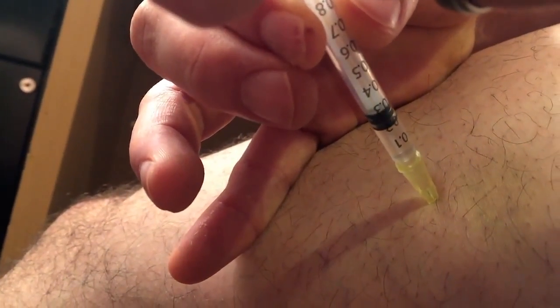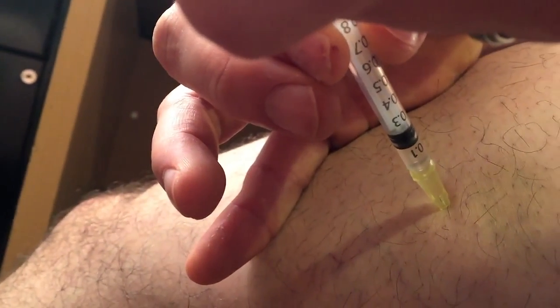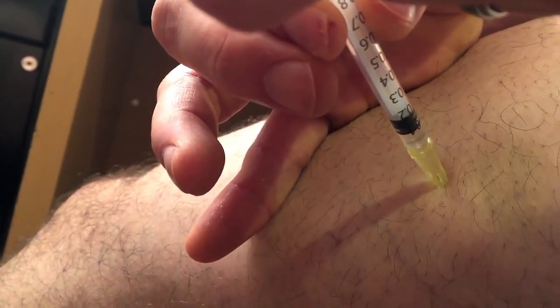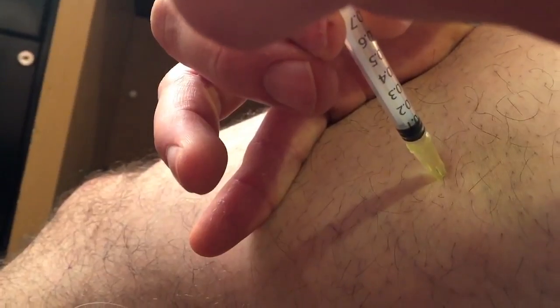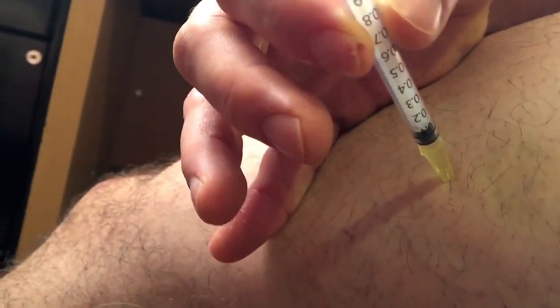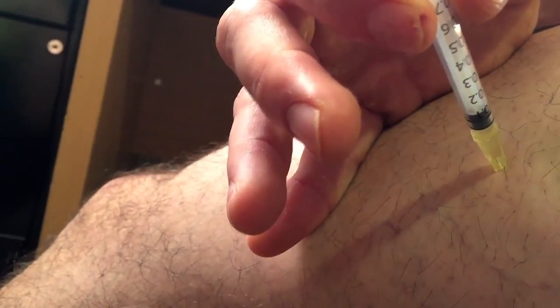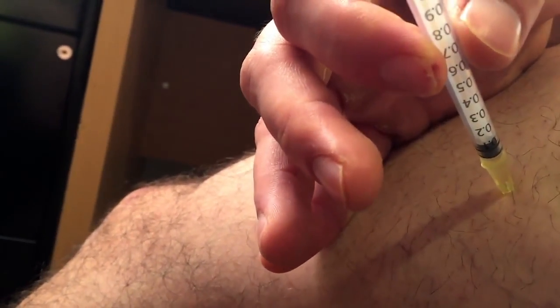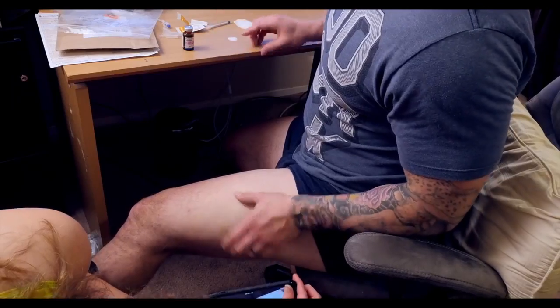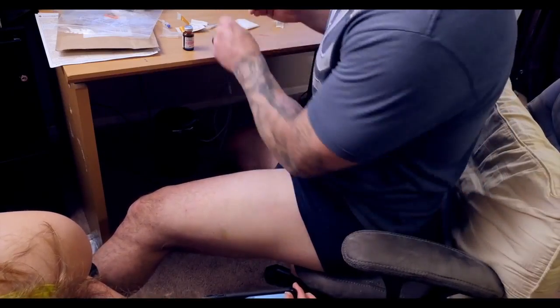This part takes a while with a needle this small, but I really like it because a 30 gauge needle you just don't feel, and that's really convenient. You have to give it a fair bit of force, but you don't really feel anything, especially if you hit the right part of your outer quadrant. I give it about 10 seconds to disperse within the muscle, since this is intramuscular. Then you pull out the needle and put on the band-aid.